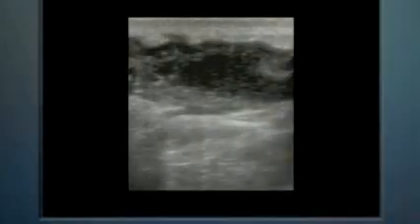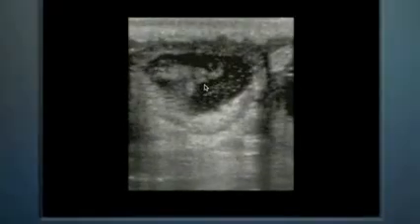Now, this, on the other hand, is what an abscess looks like. Notice we compress the tissue and we can see this hypoechoic debris swirling and layering out in this area. Adjacent to the abscess, we do see signs many times around the abscess of combined cellulitis or some cobblestoning, but here this is all clearly abscess material seen with its hypoechoic debris.